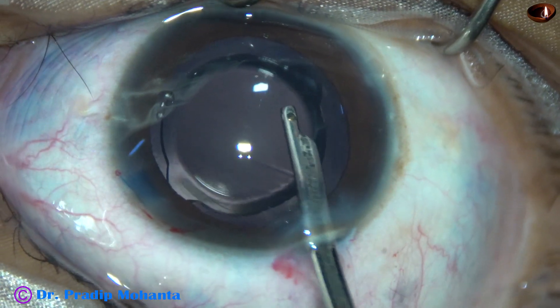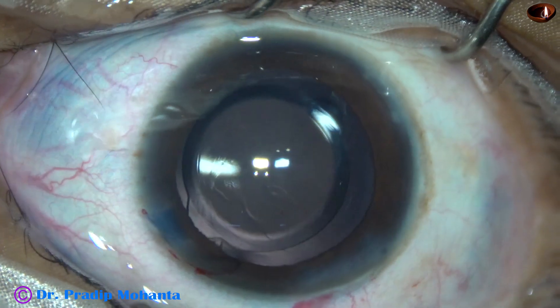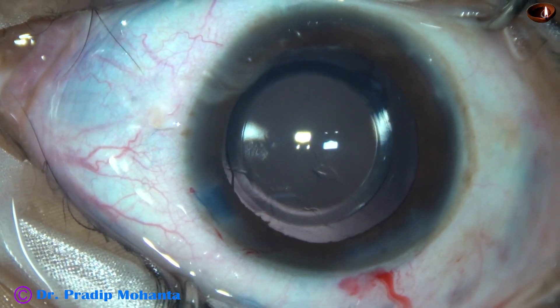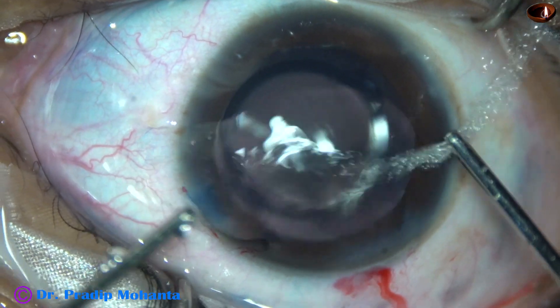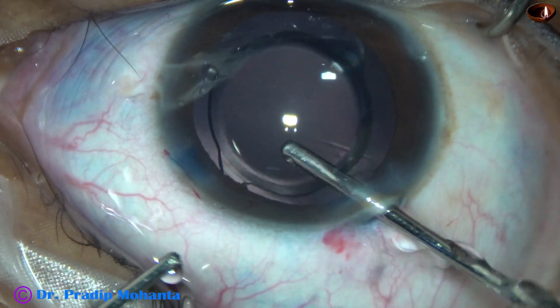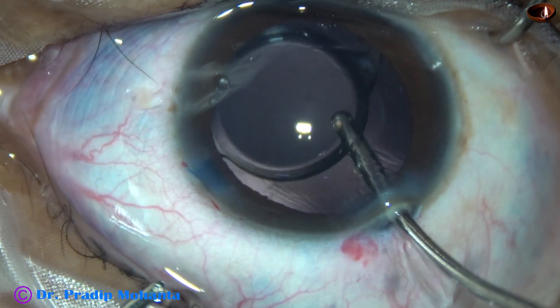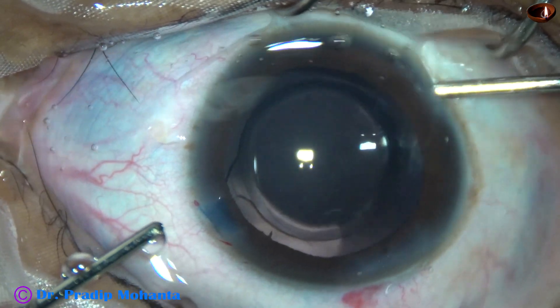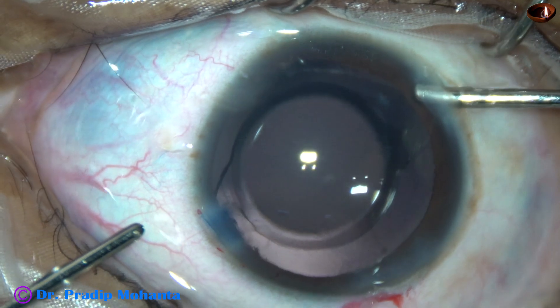Viscoelastic is nicely cleaned. We must remove visco from the anterior chamber, from the anterior chamber angle, and we must go behind the intraocular lens. After using Simcoe for some time, I ask for bimanual irrigation-aspiration. Irrigate first, go behind the intraocular lens, irrigate the capsular bag, and then use irrigation and aspiration together. Most of the visco — almost all — comes out.